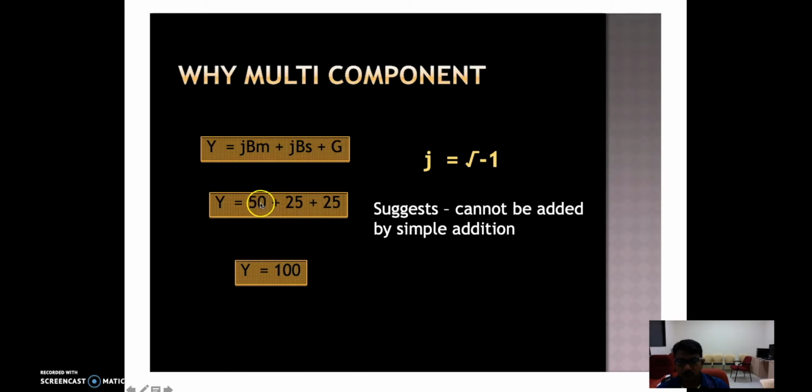Here there is more contribution still by the mass component, right? But there is some amount of contribution even by stiffness and resistance, which could still make up the total impedance. But in this case, if I am going only by the previous notation where I am just measuring the stiffness component, I would be measuring only this instead of representing the total admittance. The total admittance could be 100 units, for instance. Rather, by measuring a single component, I'm only reporting this much, which is not the actual picture of what goes on inside the middle ear.